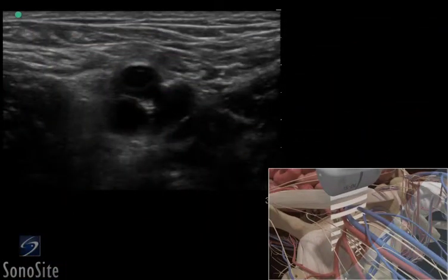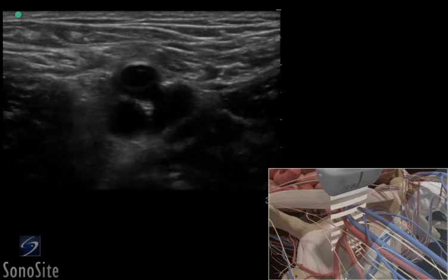The superficial femoral artery is seen as a dark, anechoic, pulsatile circular structure in the mid-portion of the ultrasound image. Deeper and slightly to the right of the image, the femoral vein will appear as a dark, anechoic elliptical shape that is compressible with transducer pressure.